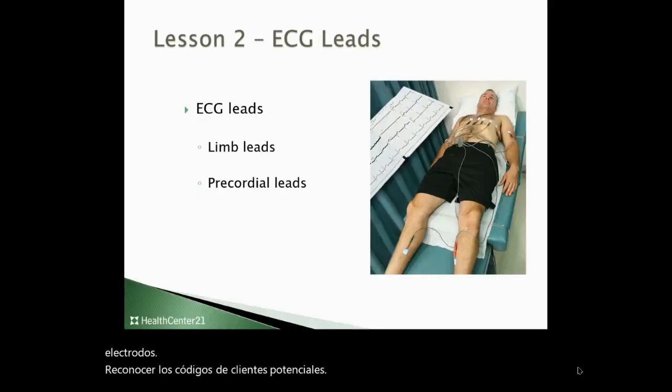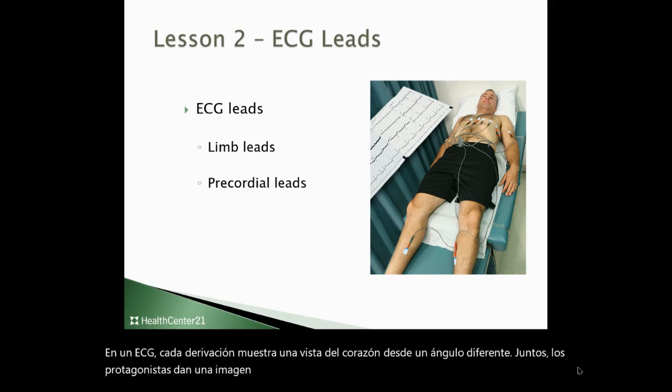ECG leads. In an ECG, each lead shows a view of the heart from a different angle. Together, the leads give a picture of the electrical activity in the whole heart. By analyzing different leads, the physician can pinpoint the source of certain problems.